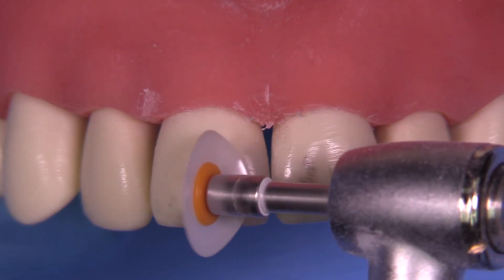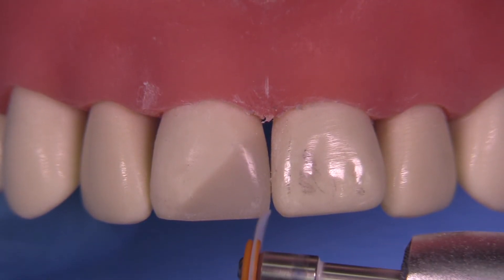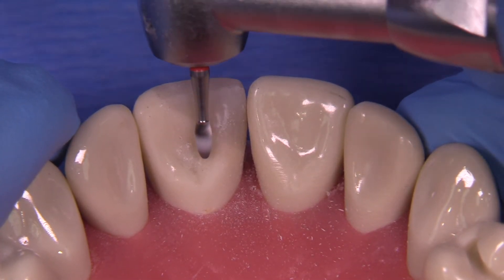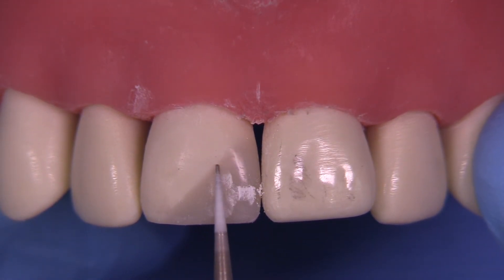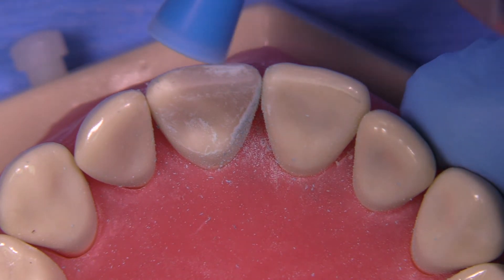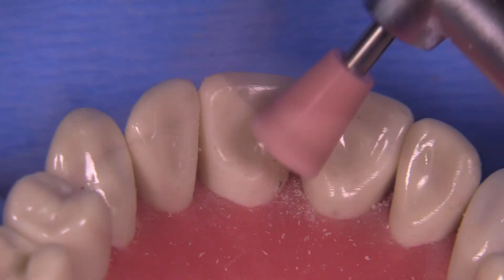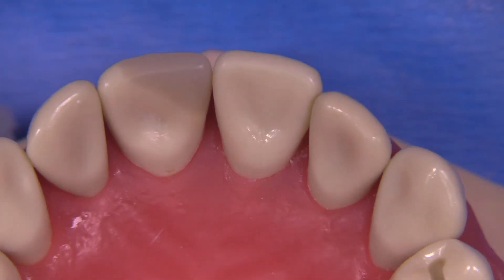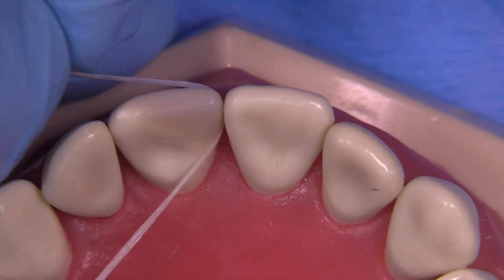We're going to continue to use the discs to create the anatomy and the line angles, and then we're going to need to go into some of the microanatomy after that. It's all about the negative spaces as much as it is about the positive spaces. So depressions and these minor irregularities you see on the surface will help to create the kind of optical effects that you're looking for. So pretty straightforward, but it can take some time — so take your time. Get your line angles correct, get your embrasures correct, and then worry about the surface texture and the microanatomy as you get more competent in this particular procedure.